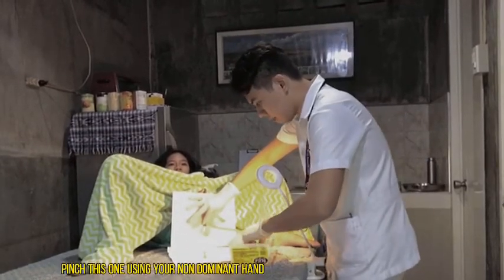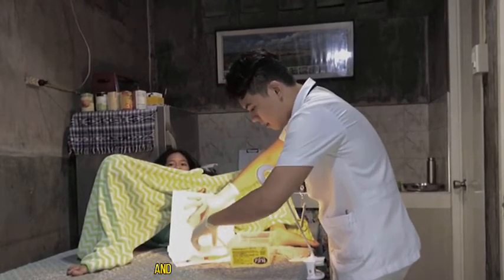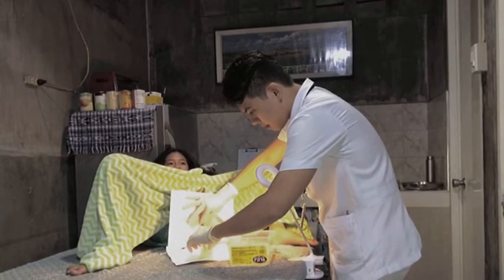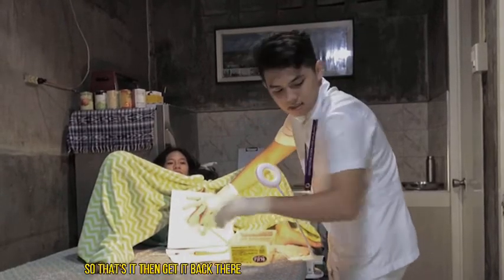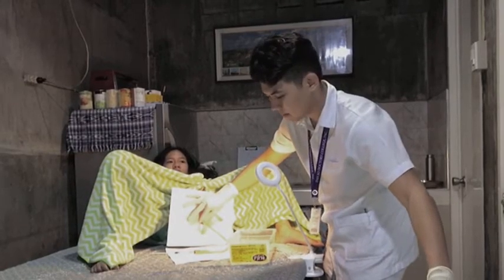So pinch this one using your non-dominant hand and just put everything here. So that's it. Then get it back there for specimen collection.